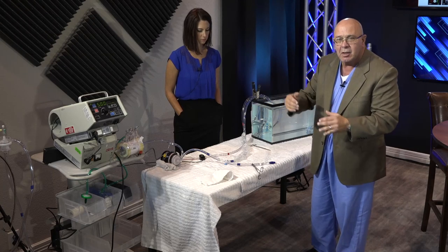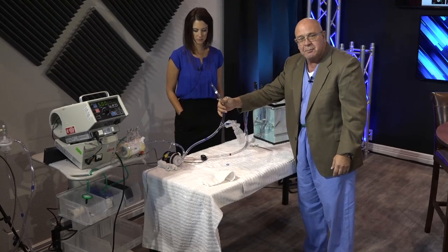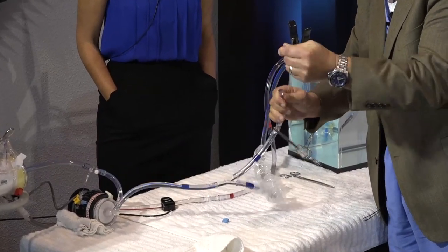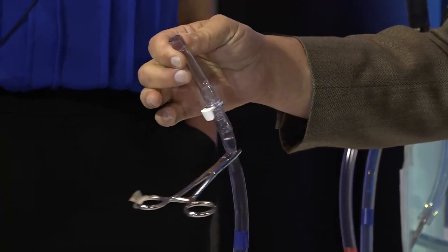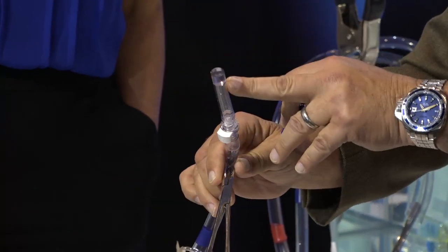So I'm going to bring it over and show you how it's designed. This is our venous, and for the PERT team, this would be the extra line that would already be built into the pack. And if you look right here, this is actually a plugged line. So this won't come out, nothing will happen if I take off this clamp. There is some air in it right now, so I'm not going to take it off, to make sure I don't suck any air into the system. But I have a clamp on it as well. But it is a plugged line, okay?